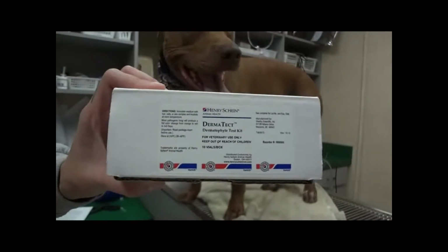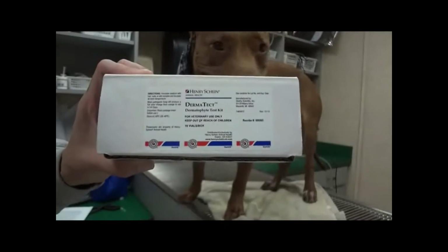Dermatech is the brand that we use for the fungal testing from Henry Schein. The reason we would run any type of dermatological fungal testing would be animals that have lesions present, pustules or papules that are present, cases such as ringworm where we want to confirm that further than just using a Wood's lamp, which is not always 100% accurate, and animals that have a history of alopecia.